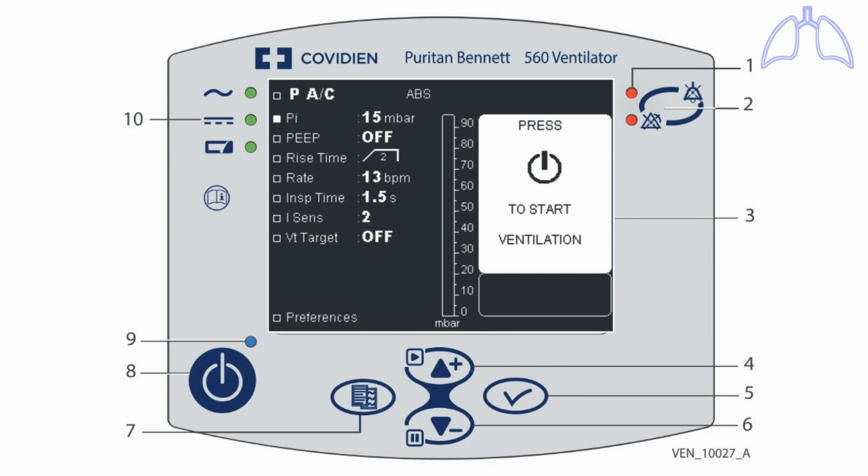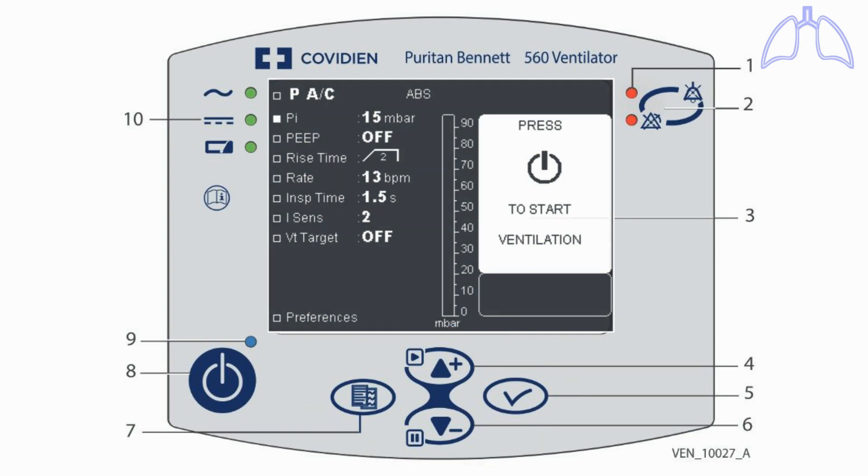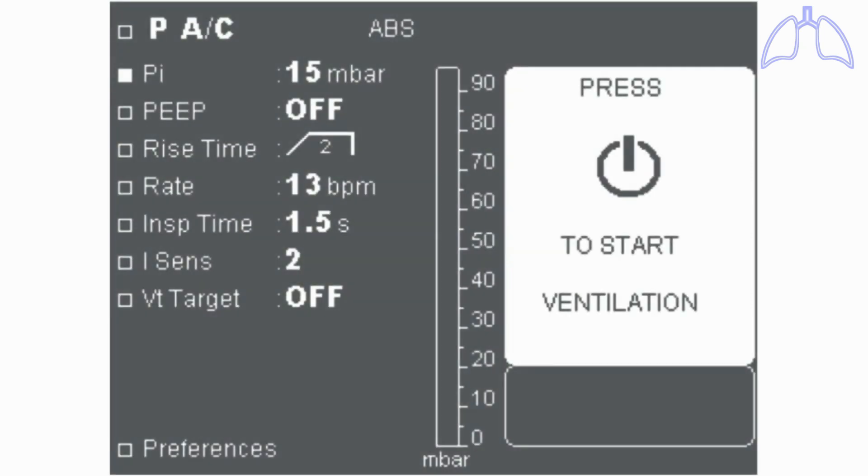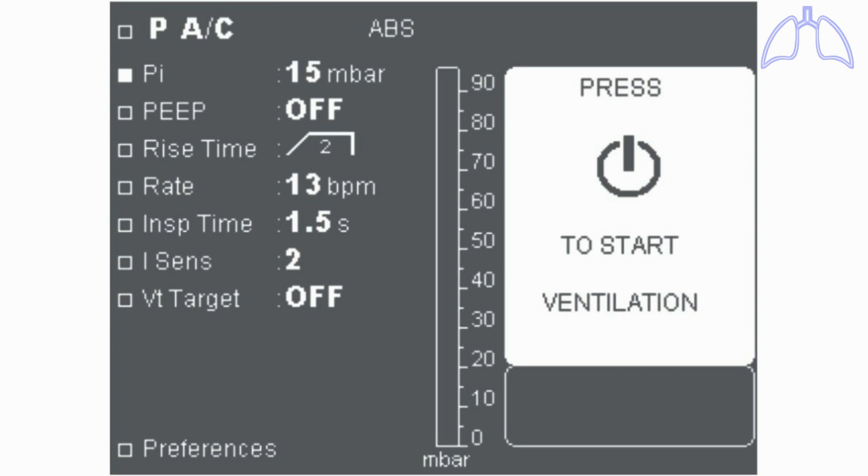The clinician uses these buttons to configure the settings to be suitable for the patient. Then the ventilator becomes ready to start ventilation just when the clinician presses the start button.